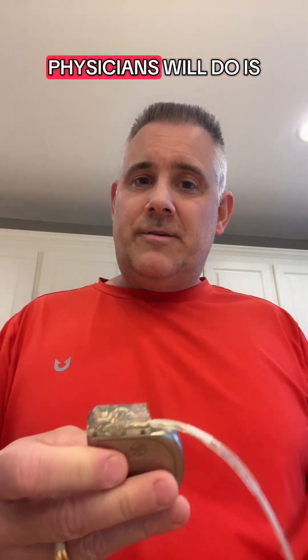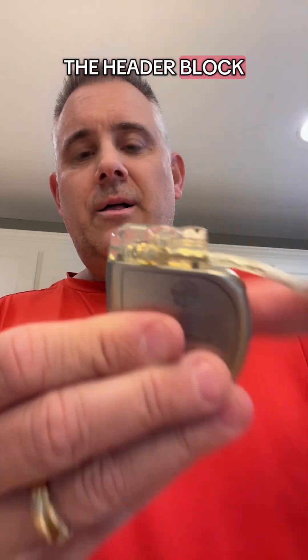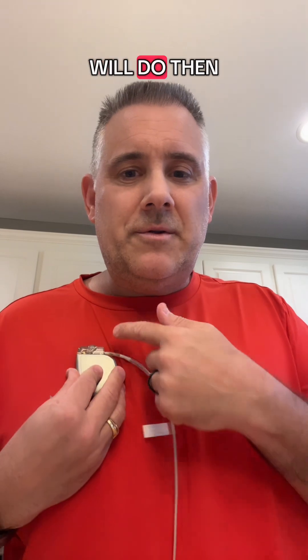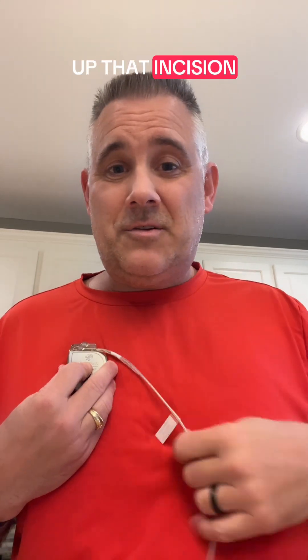What most physicians will do is use the two little suturing holes on the top of the header block. They will suture this device down to the muscle in your chest before they close up that incision.